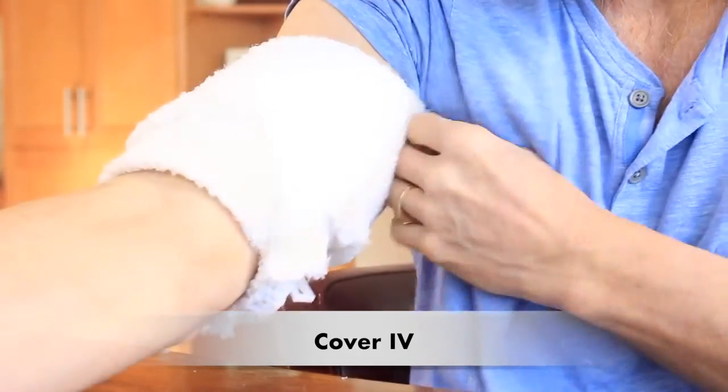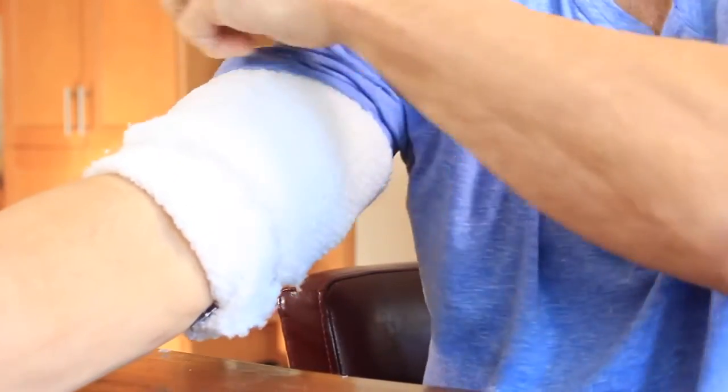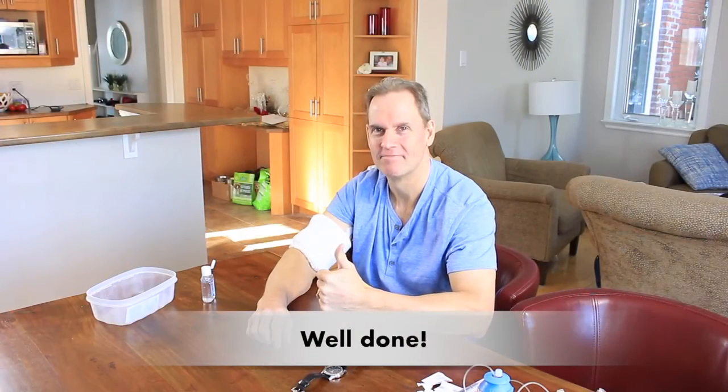Now you need to, of course, throw out the supplies, including the bottle, as your nurse showed you. And you need to wash your hands. Congratulations! You did it! It will get easier each time that you do it. Now, a few key points to remember.